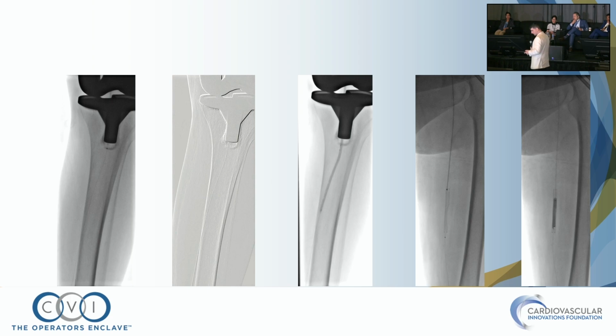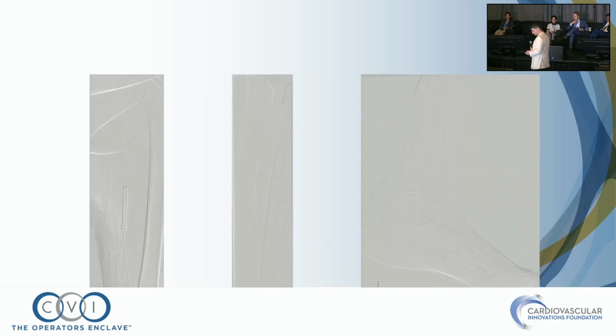So here again, thrombectomy just into the TPT. Can you play the second panel, please? No surprise, I think now the thrombus went, we got lucky. I mean, this is still not the one. Okay, so here the result, not impressive. We did balloon angioplasty now, and we addressed the SFA. We put a stent, we post-dilated, and I'll show you pictures in the next panel.